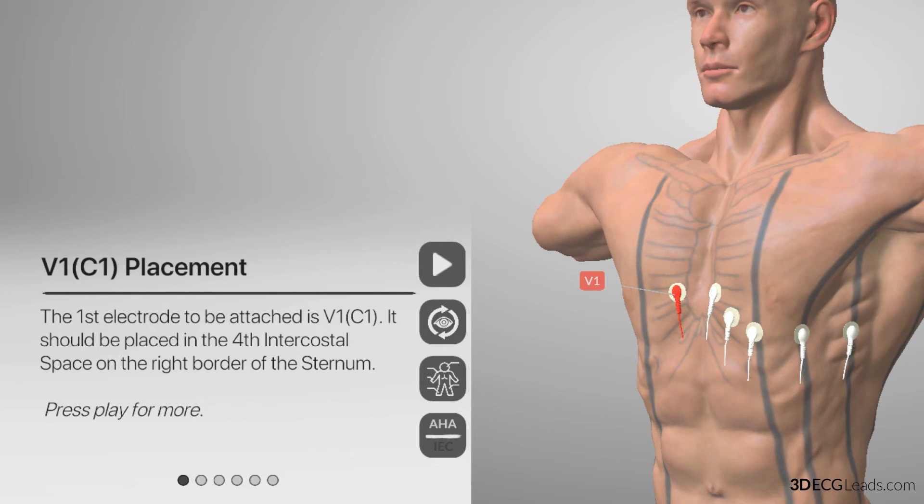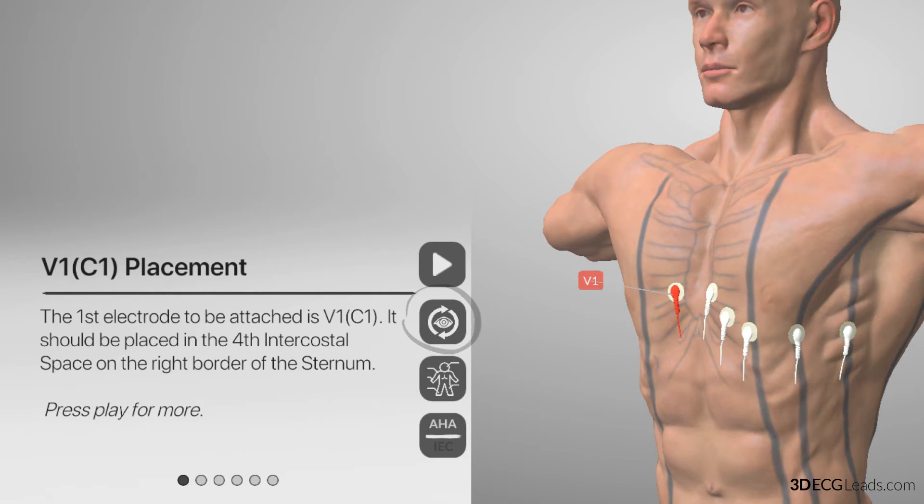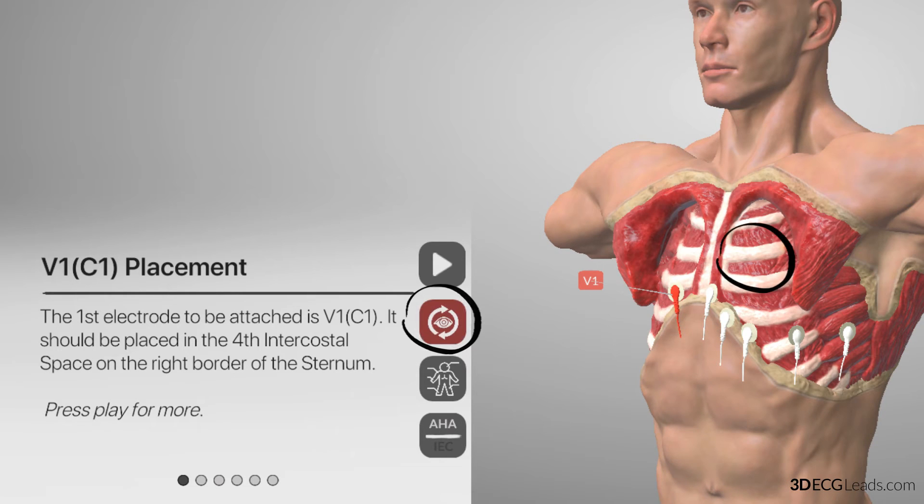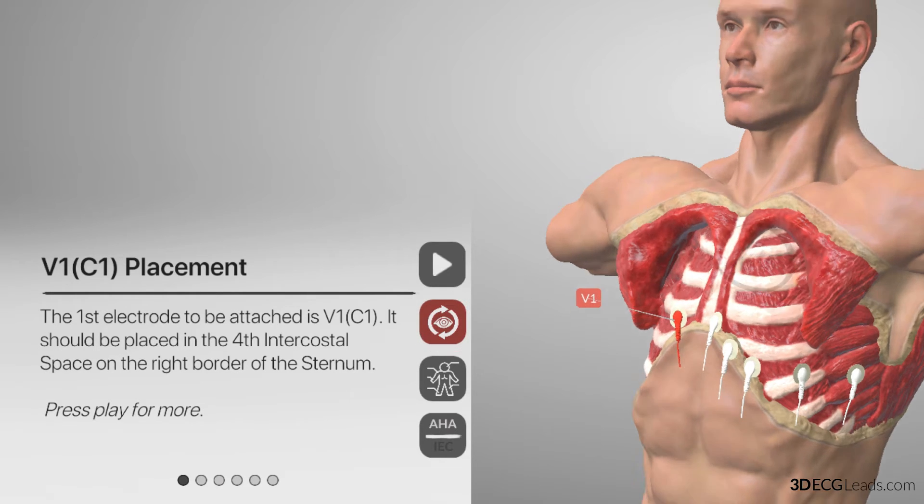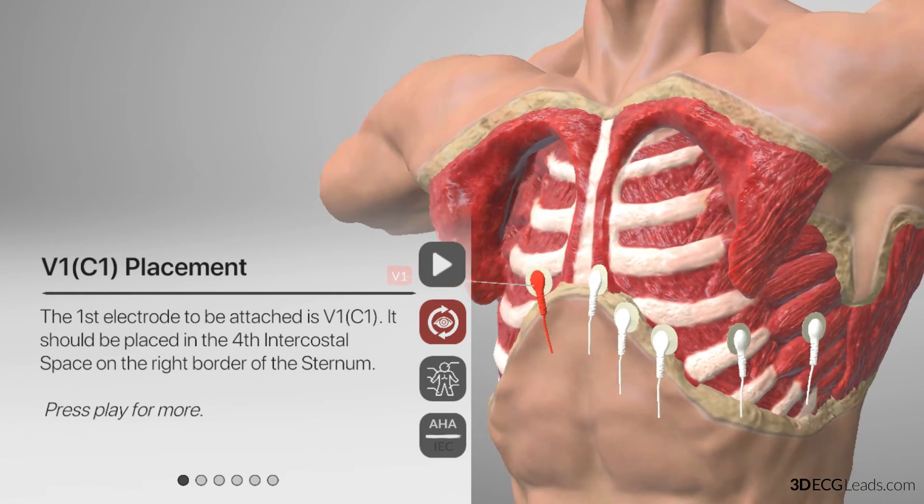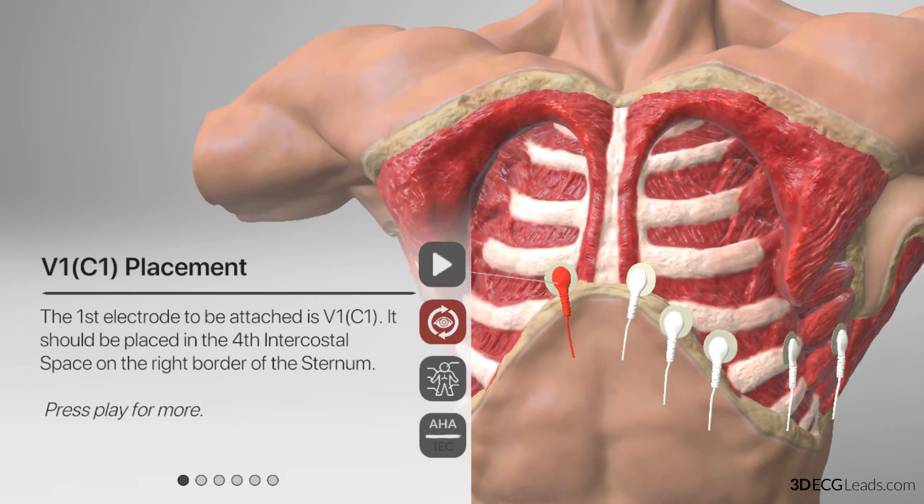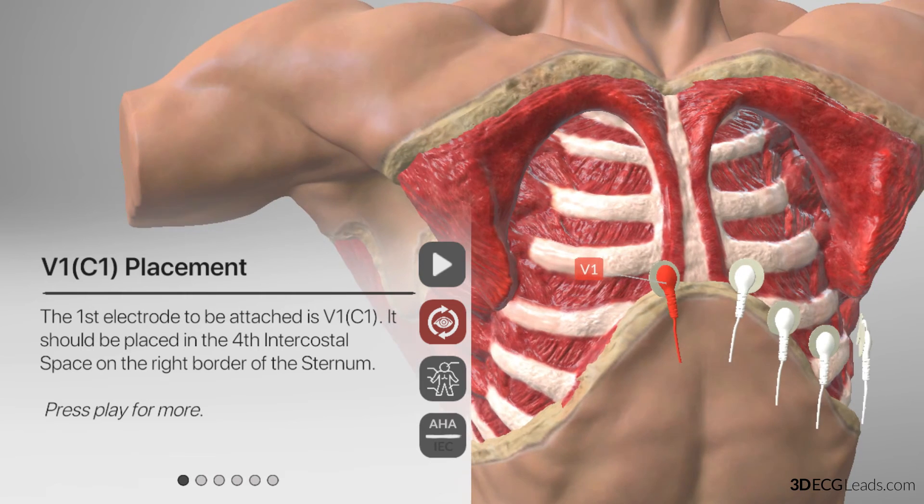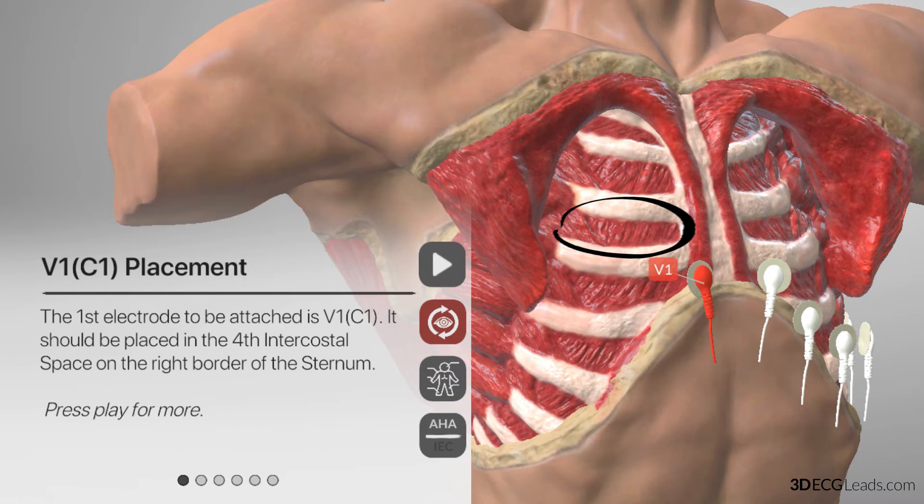To do this, we can switch the 3D model to its secondary view, which is the second square button down with the eye icon. Now we can see the ribs as they travel around the chest, and how they articulate here with the breastbone, also known as the sternum. As you can see, there is a gap between the ribs that is filled with some muscles, and this gap is known as the intercostal space.